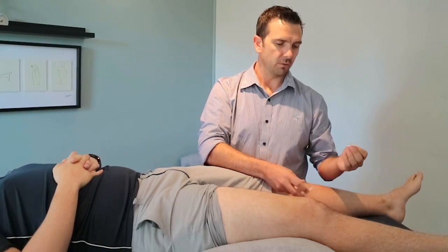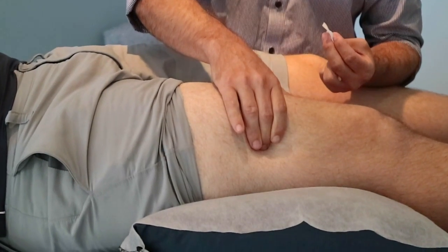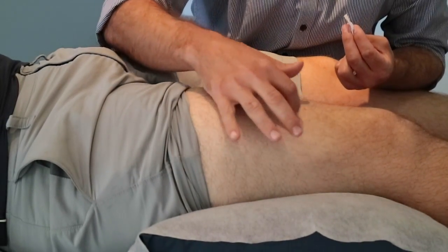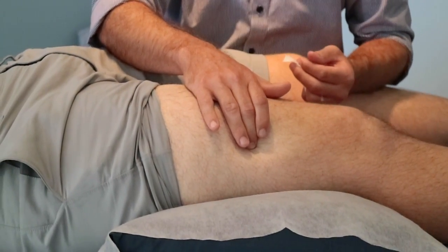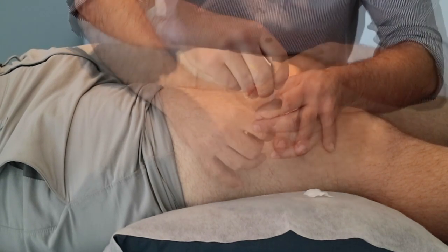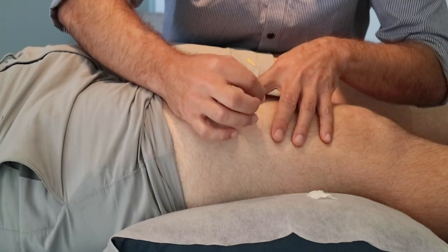Alright, so as usual, we're getting our medi swabs, and we're going to be doing the VL, the vastus lateralis, first. Now, the VL is a really beautiful trigger point because there are a bunch of trigger points that work up the lateral part of the leg, and they come down to this crescendo of trigger point loveliness in this region, which has a tremendously good effect on any type of knee pain. So we're going to be cleaning that spot. I know exactly where it is. I've been feeling it all day, and we pop the guide tube in, tap it in, and insert that needle. Now I've gone a little bit too deep on that, so we're just going to find that trigger point, and off it goes.